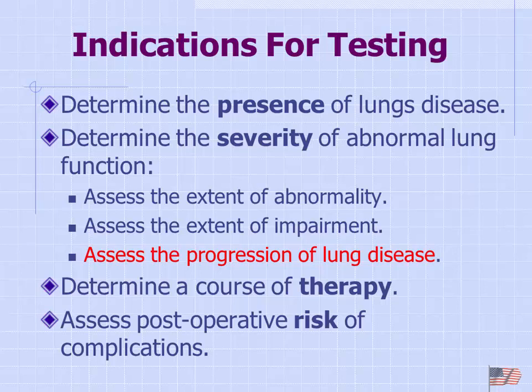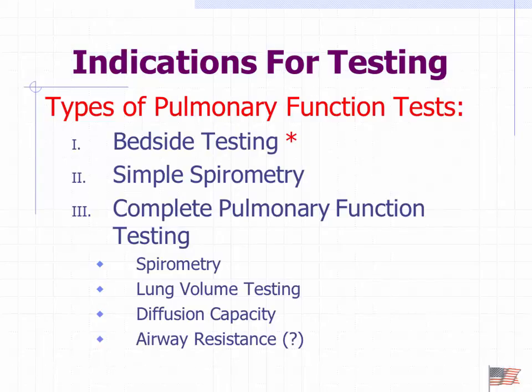You'll also see it in the hospital as far as just a bedside screen. Preoperatively, the anesthesiologist may want to know where this patient's pulmonary status is. The worst time to find out that they have some lung disease is in the middle of surgery. So they want to have something up front so they can anticipate this patient may need some alteration in their anesthesia delivery, and we may have to expect some altered recovery process in the post-anesthesia care unit. So there's bunches of reasons why we'd end up doing it. Primarily it's to look at the extent of any lung disease present.